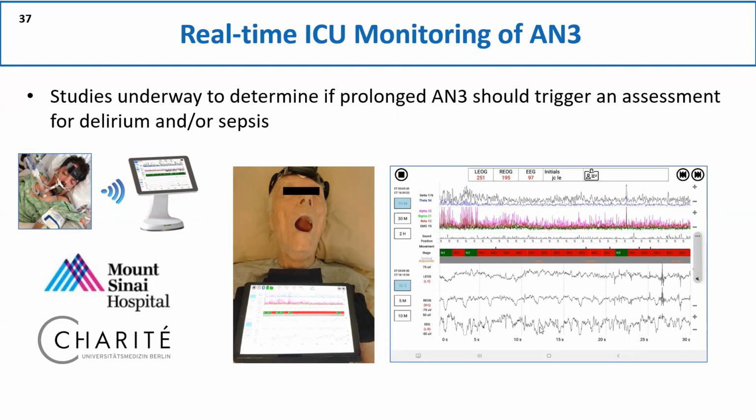If they had had this tool, they might have been able to detect the sepsis-associated encephalopathy, and maybe they would have recognized the hypoactive delirium. Or if they had this technology at the skilled nursing facility, they could have identified the risk of sepsis, run the test, and gotten them back to the hospital.